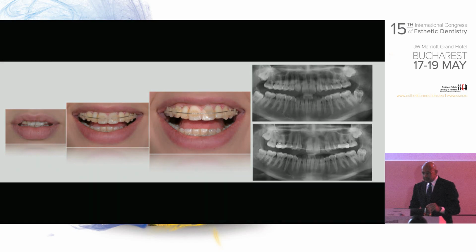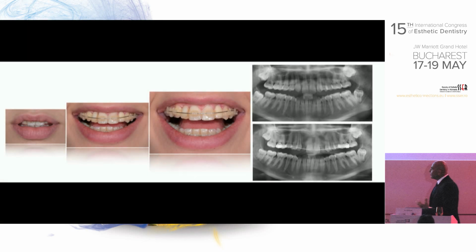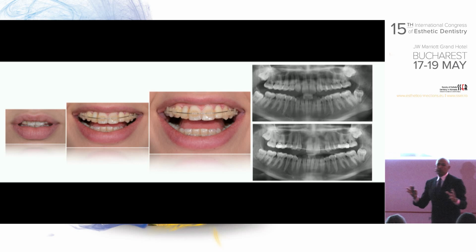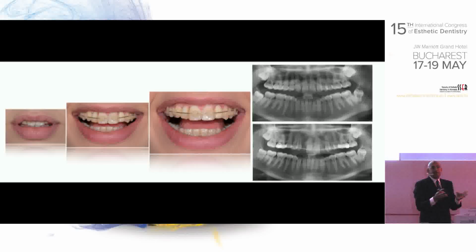So look how extremely narrow the space he created, even though it's a huge difference between how he started versus where we are now. But still, if I would be in command of the case for the time being, I would want him to move that a bit more. But as I told you in the first workflow, there's also another entity in the whole process, and it's the patient.